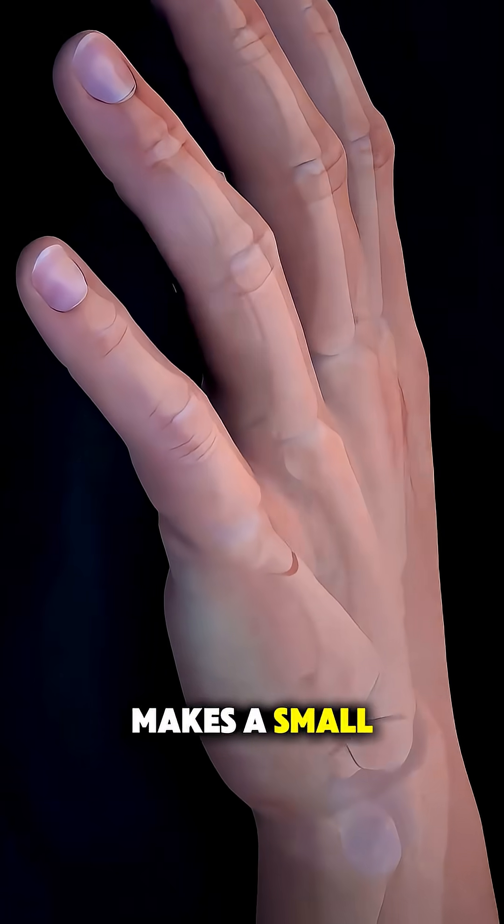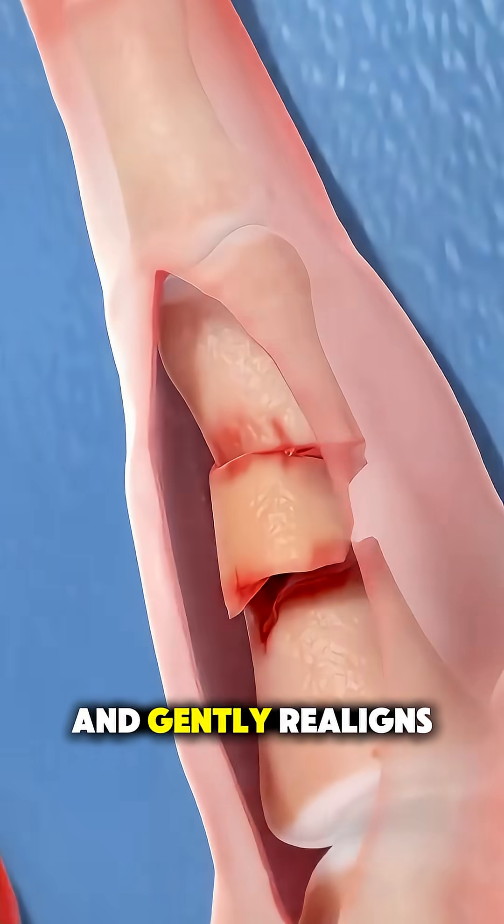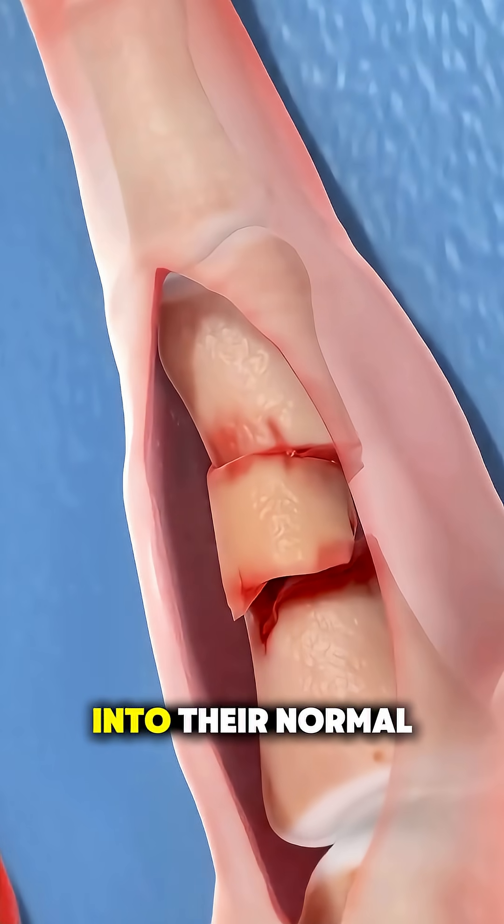The surgeon then makes a small, careful incision to reach the fractured bone and gently realigns the pieces back into their normal position.